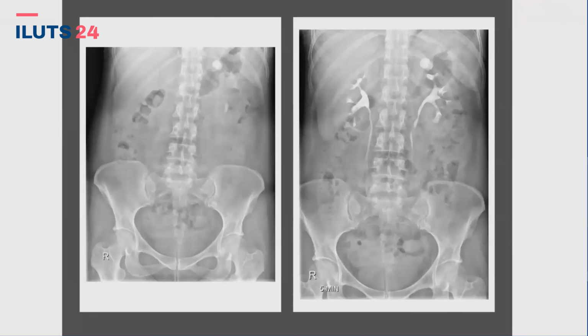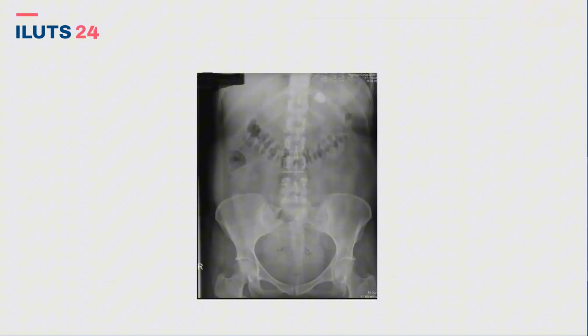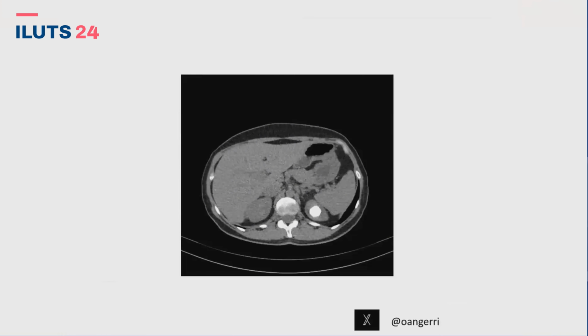Sorry, I'm going to show you the CT scan. I show you just the CT scan to show you that it's really a kidney stone, and the stone is like above the spleen, right? Is the patient symptomatic? The patient has infections and fever.